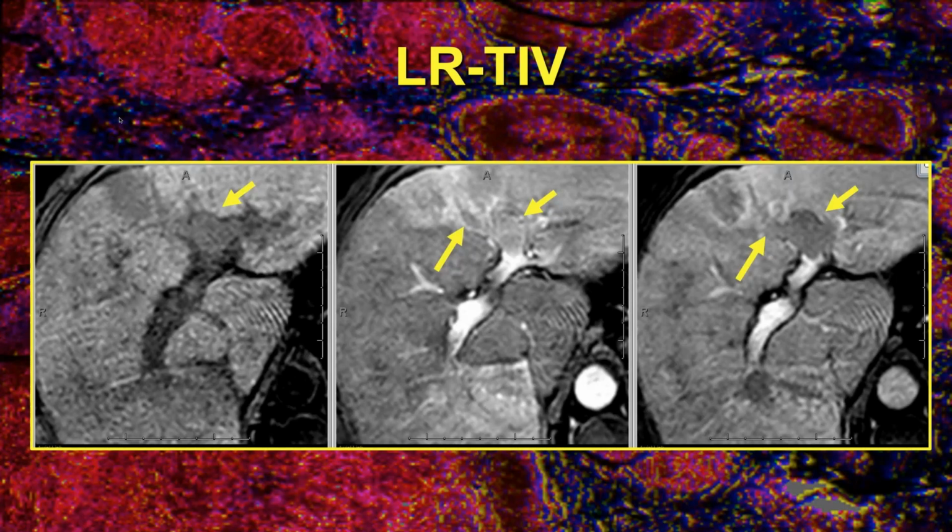Here, in contrast, there's no doubt about this one. This is tumor in vein. We called it LI-RADS TIV, not a transplant candidate, but there are treatment options. Given the hyper-enhancement and the washout, I think we have a high confidence that it's hepatocellular cancer.